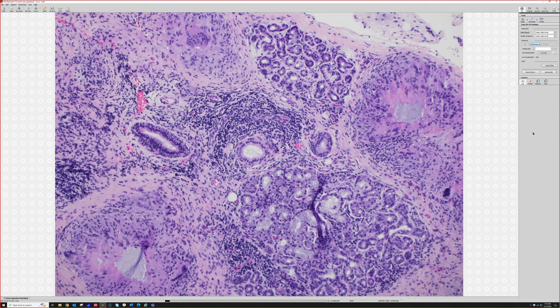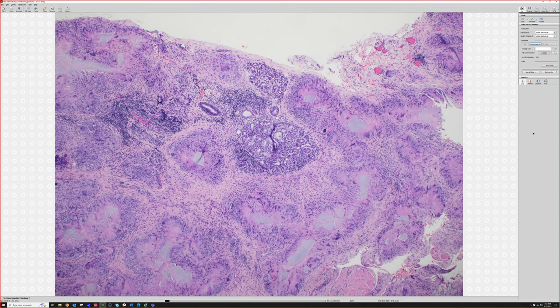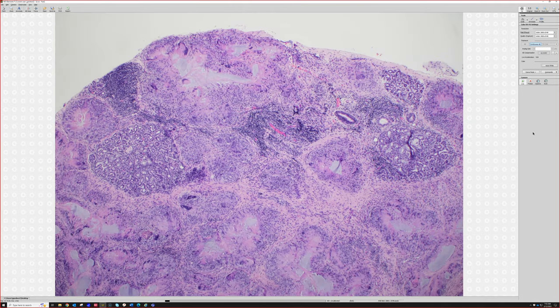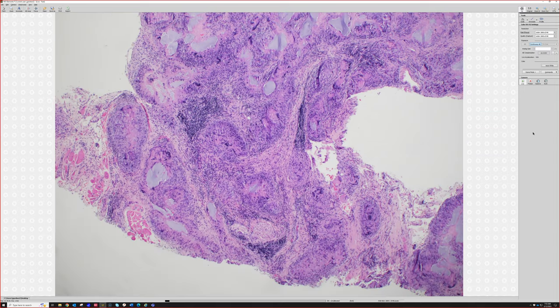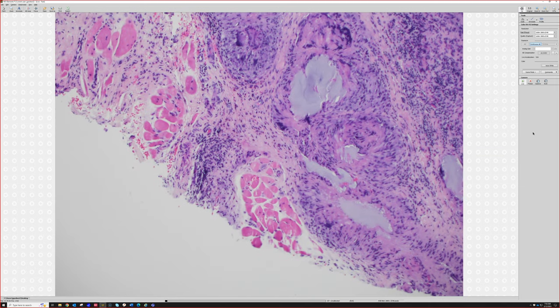So in any case, we're kind of in the mouth here. If I recall, this was actually a cheek nodule, a deep cheek nodule. And when they took it out, it was lip. Lip nodule. And so it was kind of a deeper mass. I think they thought it was a cyst or some sort of tumor. And they removed it. And so they took out some of the muscle of the lip around it. See, that's another clue where we are, skeletal muscle there.